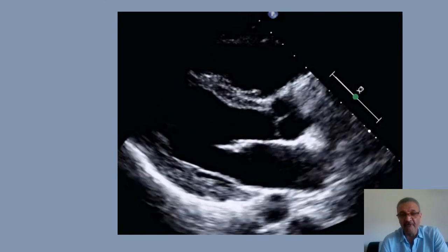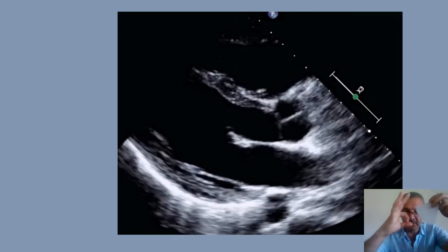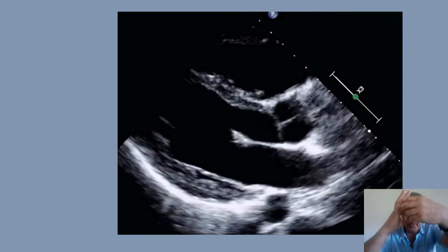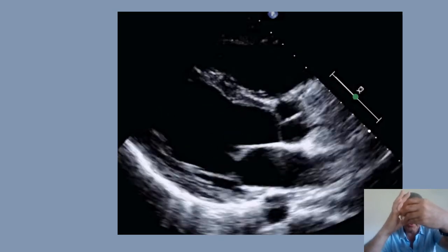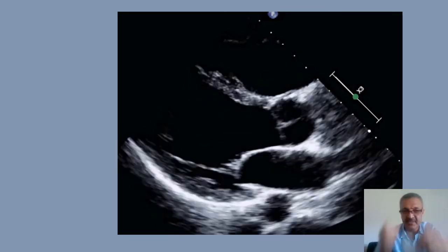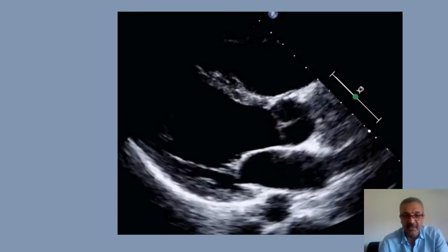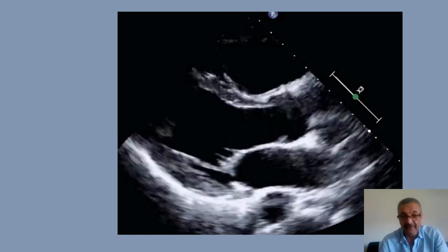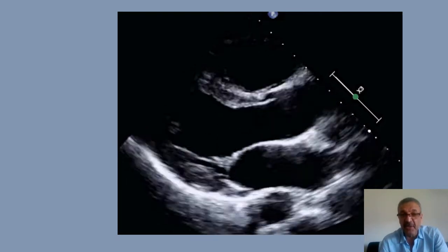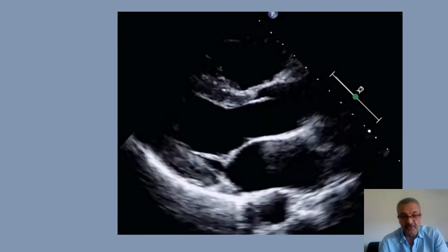If cooptation is off-center, you are off axis. Imagine this is your aortic valve — you are off axis. With a little slide and twisting, you can keep it at the center. After you have a good image, you are going to do measurement.